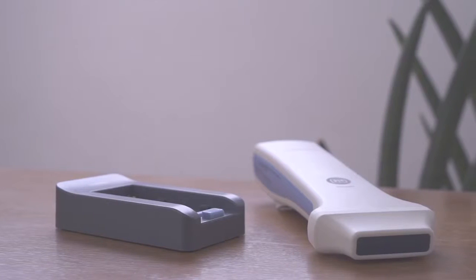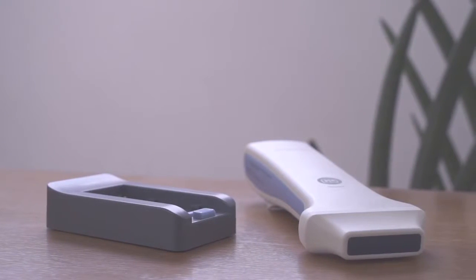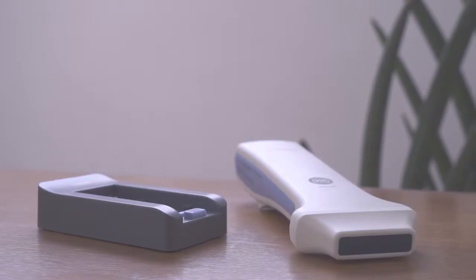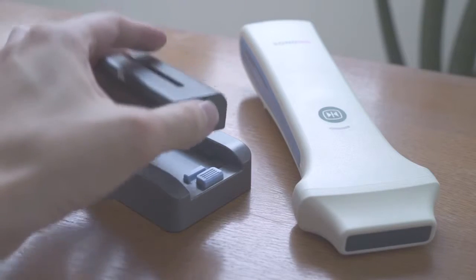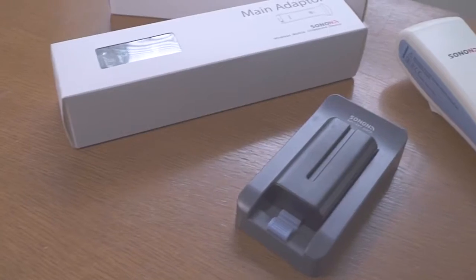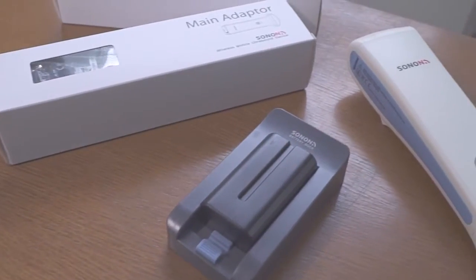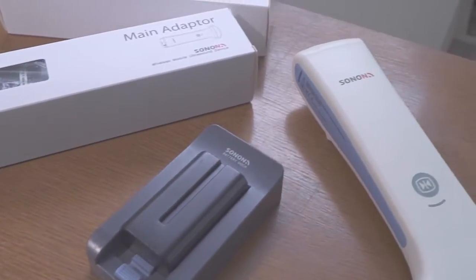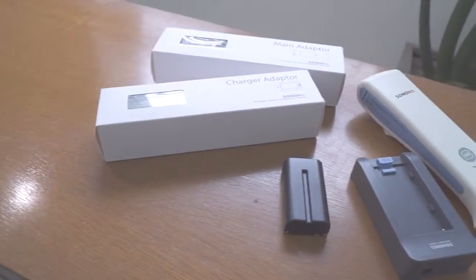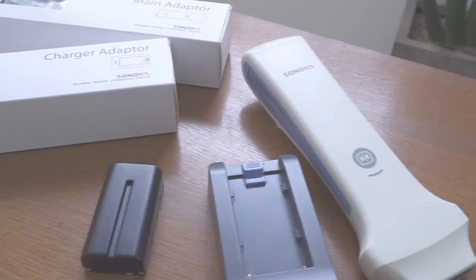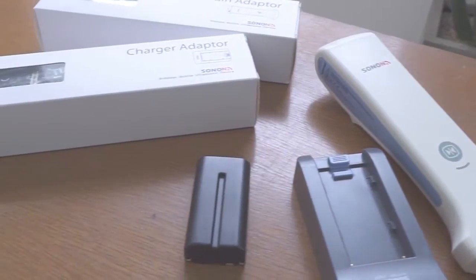Each package contains two replaceable batteries, chargeable battery dock, and an adapter, with a selected type of probe that can last up to 12 hours of standby and 3 hours of continuous scanning.